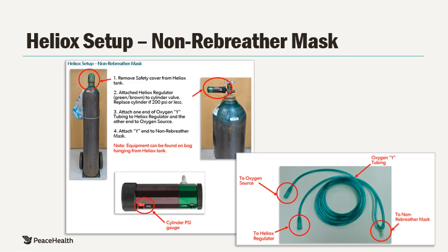All this equipment can be found typically hanging from the equipment bag on the tank itself. Otherwise, please ask your lead or educator for help locating your equipment.